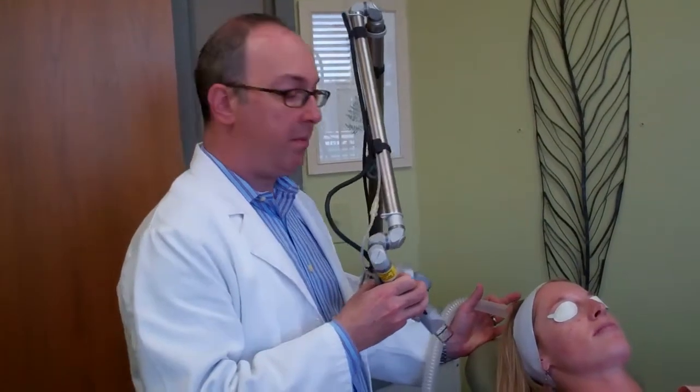Okay, so we're going to start the procedure in a minute. Jessica is ready for the procedure. All she got was a little bit of topical numbing, so you feel a little bit of numbness on the skin. No other medicines, no Percocet, no Vicodin, no Xanax, none of that. It's really not needed for this type of procedure. And the procedure will only take a few minutes, maybe 5-10 minutes tops, and then we'll talk to her after that. Okay, the time is 5:48. We're going to get started right now.